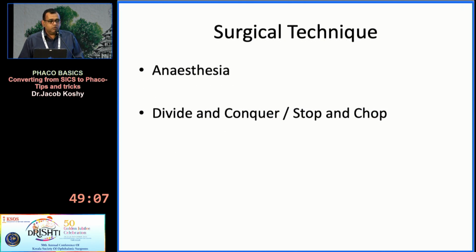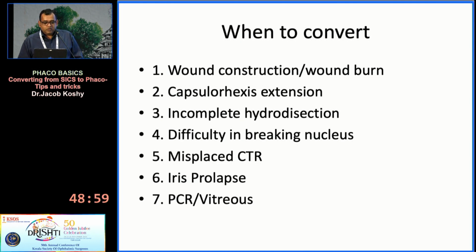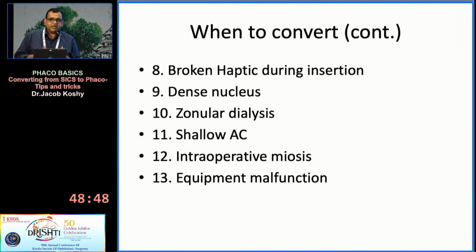Now, even if you're comfortable with topical anesthesia, please give blocks when you're learning a new surgery and decide on the technique you want to do. When to convert: when you're doing Phaco and you run into trouble, these are some of the parameters that I would look at. If you're running into any difficulty, convert back to a technique that you're comfortable with. It's more important to give the patient good vision than to say that we did the surgery in a difficult condition.